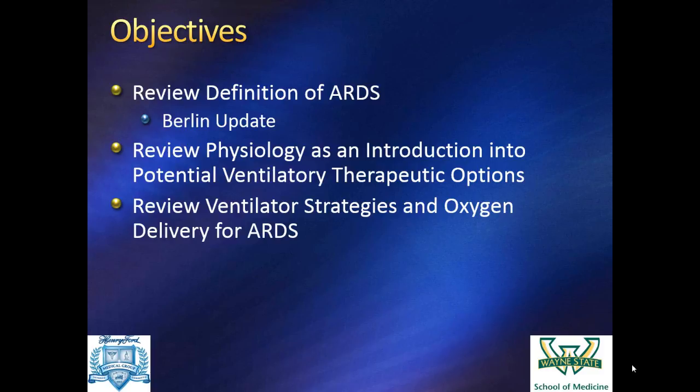Unfortunately, as I've read more about APRV and gone back and looked at our guidelines around how to use APRV, it doesn't fit at all with how I think about using APRV. Habashi's articles have always been that as long as the T-low is short enough, he says your PEEP should be zero, just because then you have a consistent flow. You're getting the peak flow to occur, so you can figure out where that 60% level is. If you go from a pressure of 30 to a pressure of 10, the peak flow is going to be less, and so you have less time to allow the patient to exhale, is what I understand him to say. I can't say that I understand all of his logic.